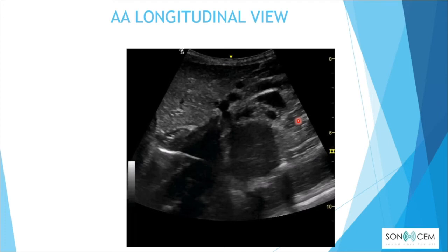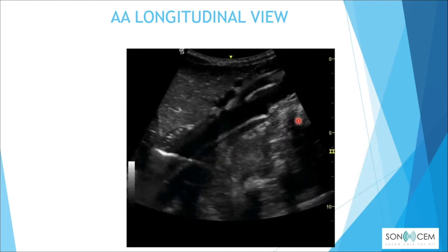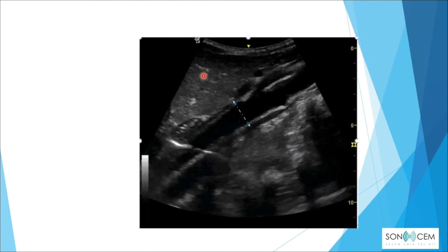For the aorta, we need to obtain two views to get a good measurement and confirm proper image acquisition: the transverse view and the longitudinal view. In the longitudinal view, we can see the celiac trunk and the SMA. The measurement in both views should be from outer wall to outer wall.